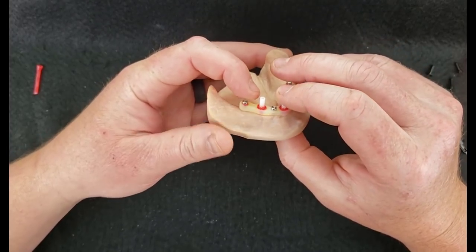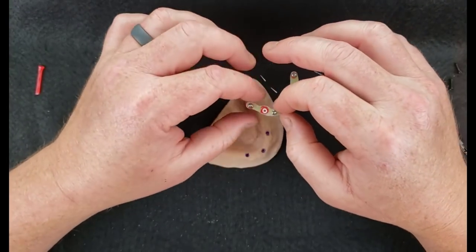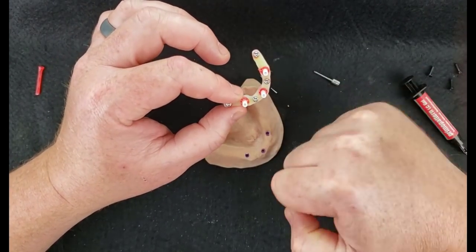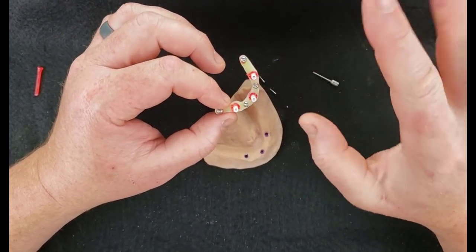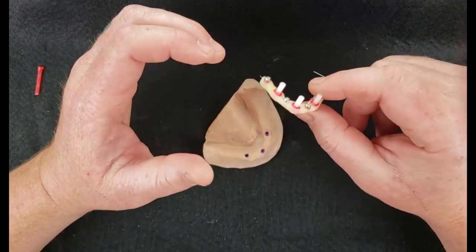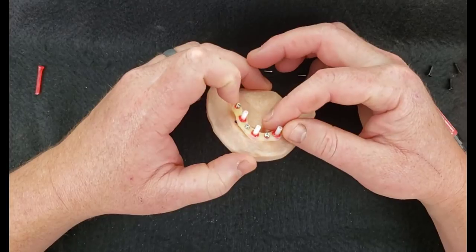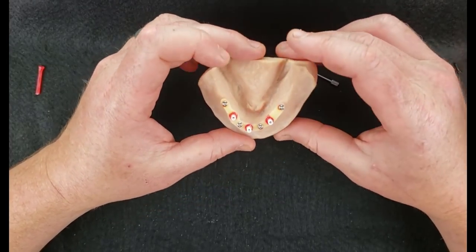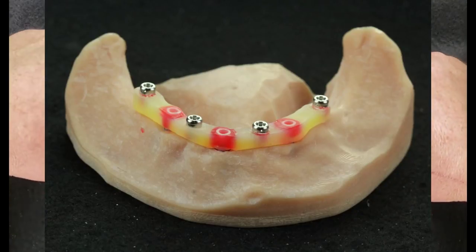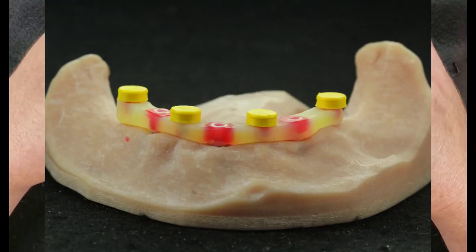And if they can't seat this thing down with just a single screw and make sure everything is seated, then what would need to happen is they would need to section it, just like a non-passive bridge or something. Section it and then laser weld it back together. So I would send to a lab that has that capability, or solder it together. I would rather have it laser welded. But that way they can ensure on their end that everything is sitting passively, and that would really complete the process. And so now you would have your locator bar, and you've been able to go from 3 implants out to a much more stable bar with 4 perfectly parallel locators, and really extended a lot farther back.